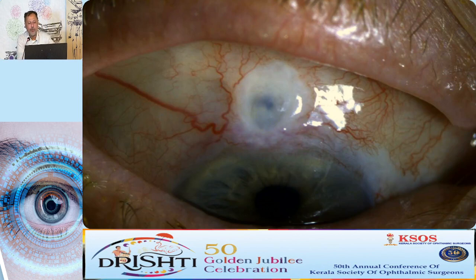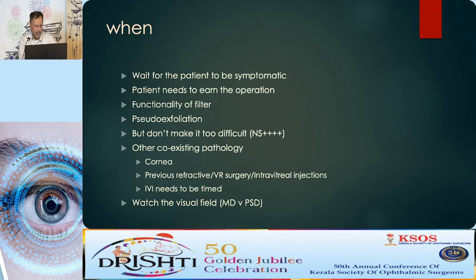So here is someone who has had a cataract operation some time ago. This was a very avascular sort of bleb. We did give her some mitomycin, and we did break the edge where the ring of steel was. And despite that remaining avascular and horrible looking, that bleb is still functional and the pressure is quite reasonable.